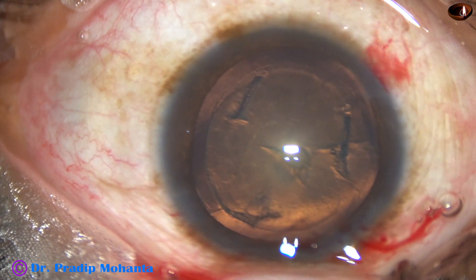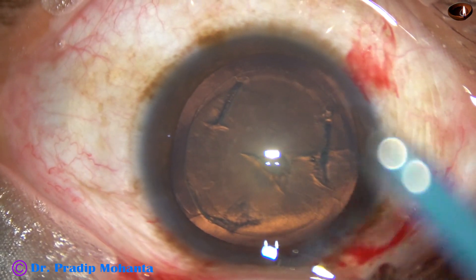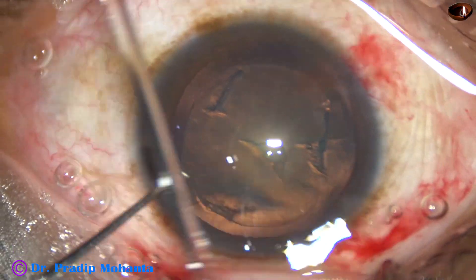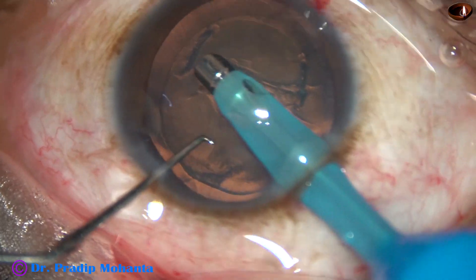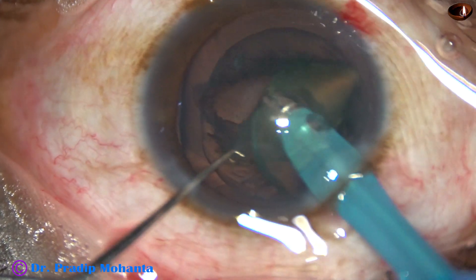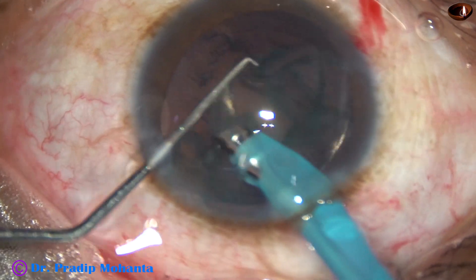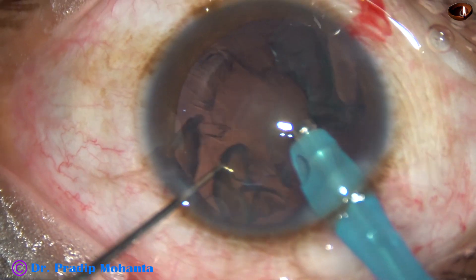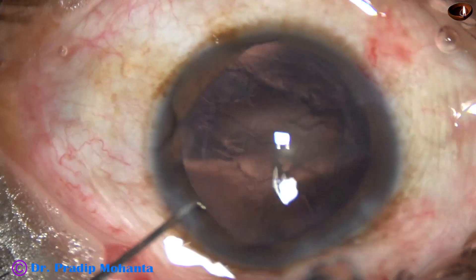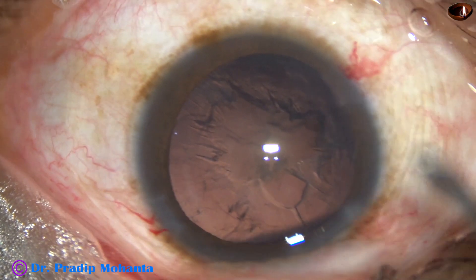Now I introduce the tip of the FACO needle with its bevel down and just apply micro-FACO. Just by FACO, without any ultrasonic energy, the whole lens comes out. So we can call this zero-FACO — no ultrasonic energy has been used.